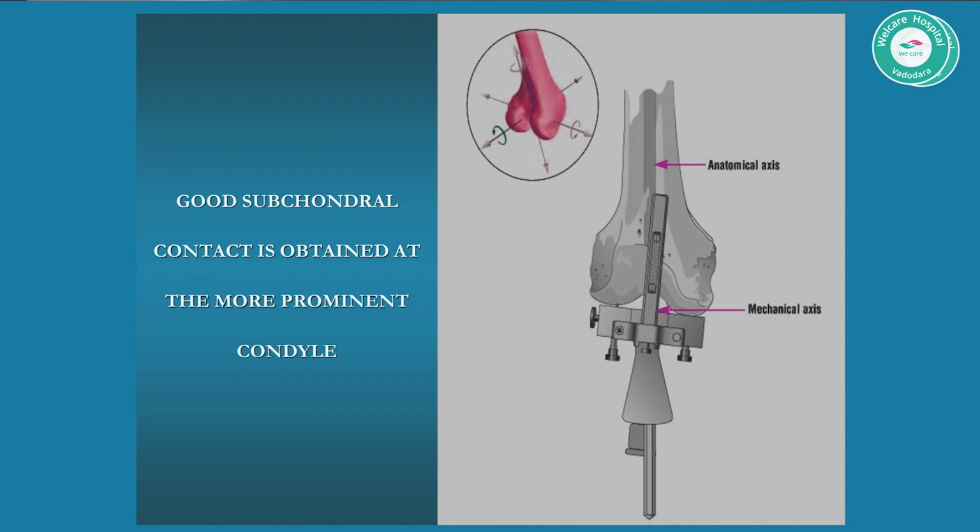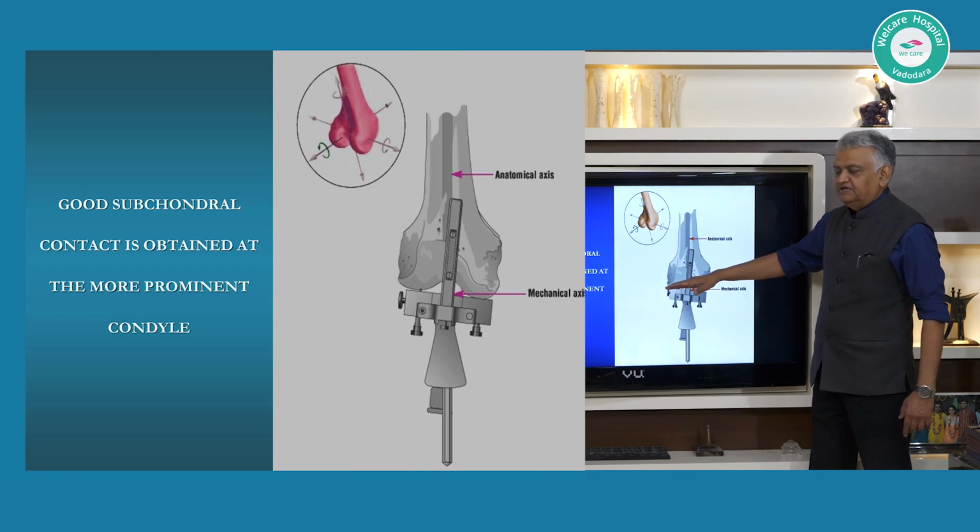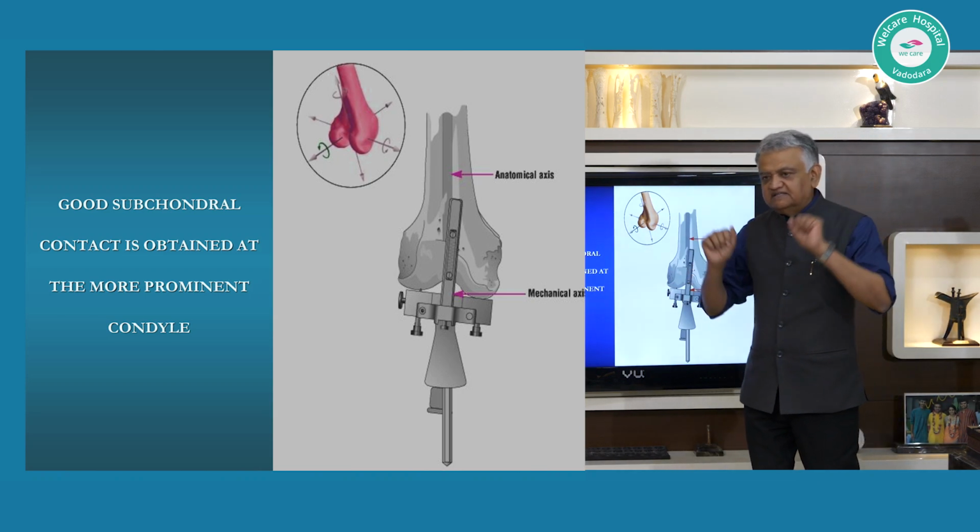You have a leg which is going like this. You took, let's say, a 5 degree cut. Open up the CPAK classification diagram. I know, but just focus. This is extremely important. It's here that it really matters. Now you have a leg which is going like this. You are taking a cut which is going to bring the leg from here to neutral. But because the movement is in this direction, the orientation of the cut that is happening here, you end up using the word valgus cut.